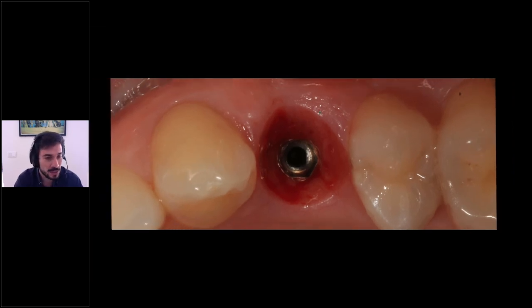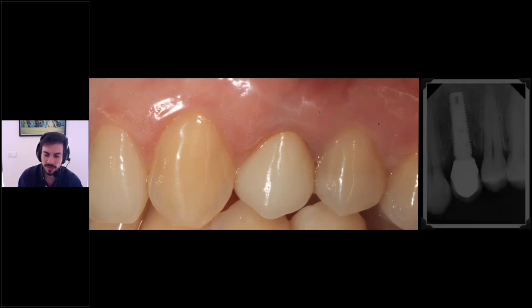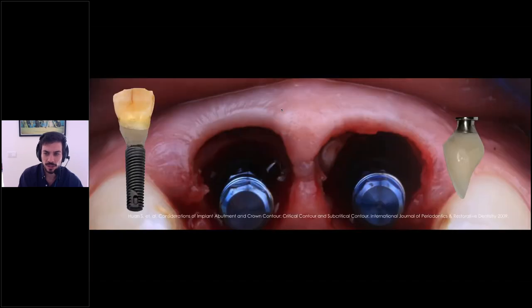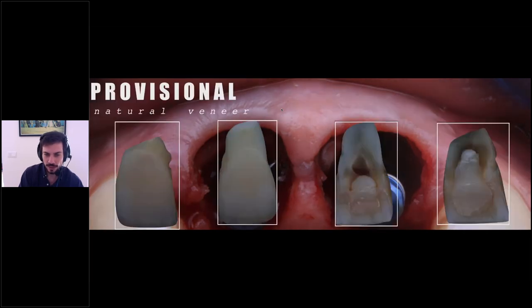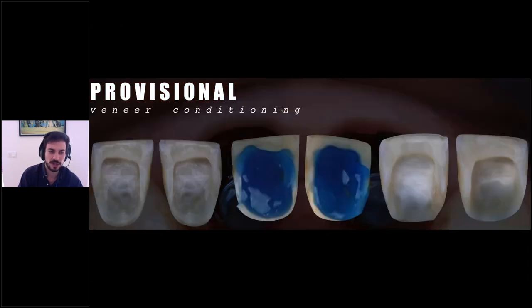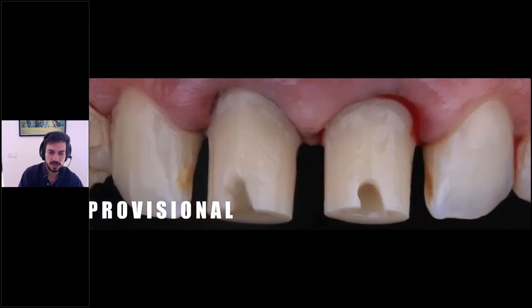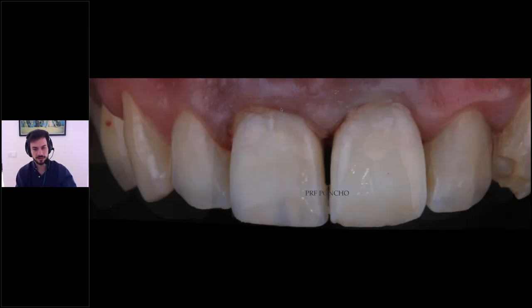There is no biomaterial, there is nothing, there is only biology working for us and giving us this kind of x-rays and this kind of results and integration of our restorations. Therefore, the critical contour and subcritical contour of our restorations should be respected. And if we have the chance, we can use the veneers of our patients to make the provisionals. We can condition our veneers, bond the veneers to these PEEK abutments, and we can get out of our surgery with this kind of results.